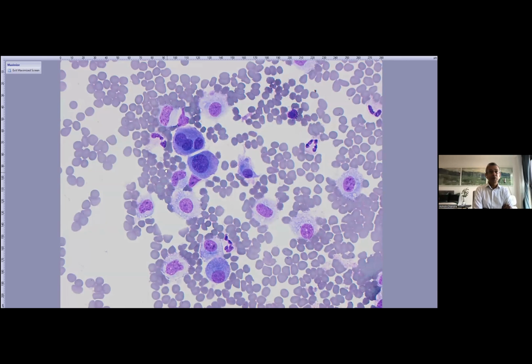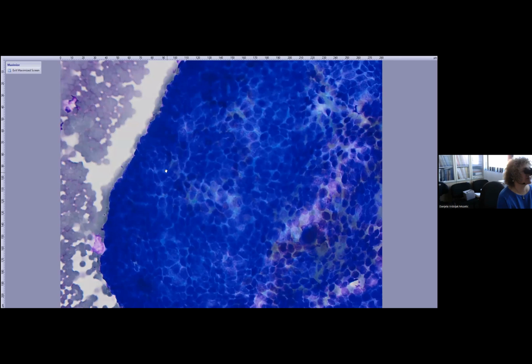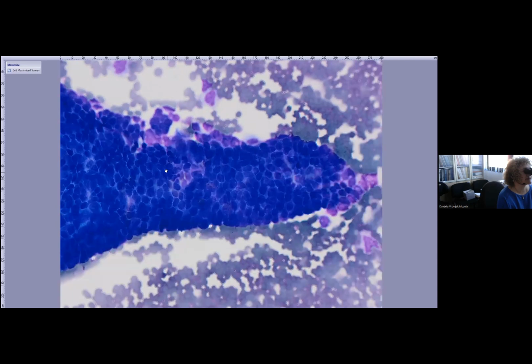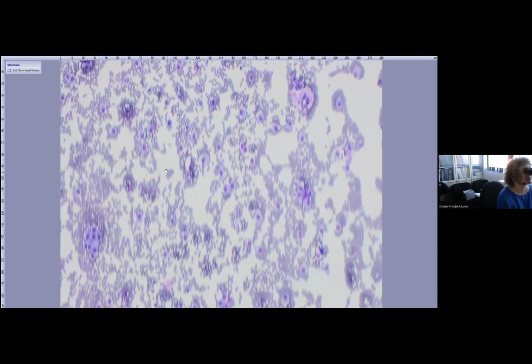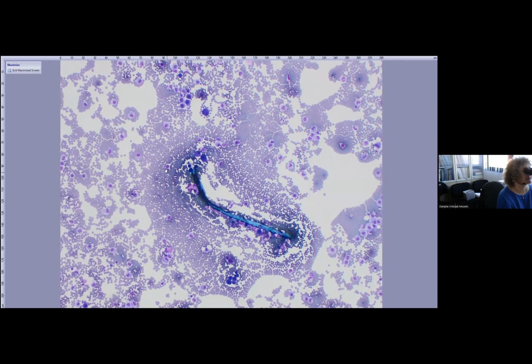They could be multinucleated or binucleated, and some anisonucleosis like here. Also we have here a big cluster of smaller cells. Mesothelial cells, when they desquamate, can also look like this. But we weren't so sure, because we knew that the patient had a malignant ovarian tumor.